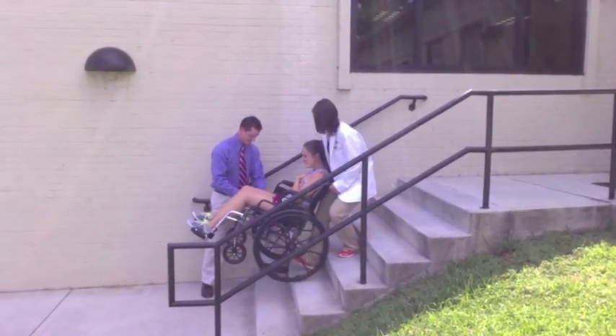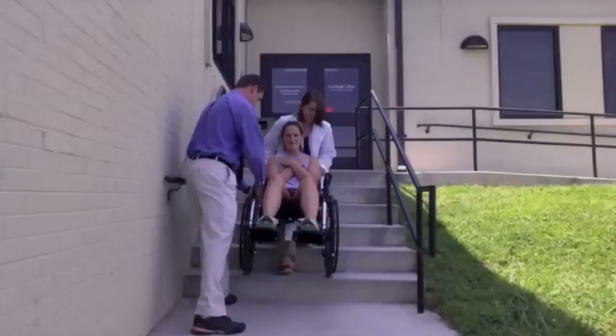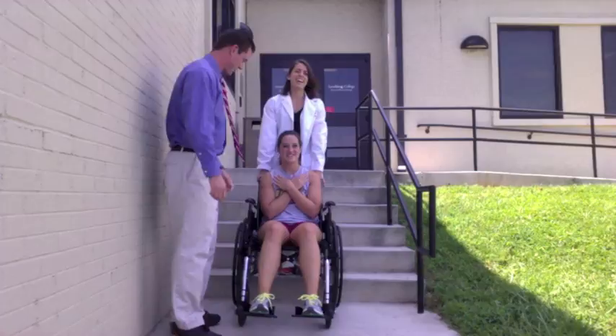The process is repeated, stopping the wheelchair on each step to halt momentum. When the last step is descended, the clinician lowers the casters gently to the ground and the transportation is continued or the wheelchair is secured.